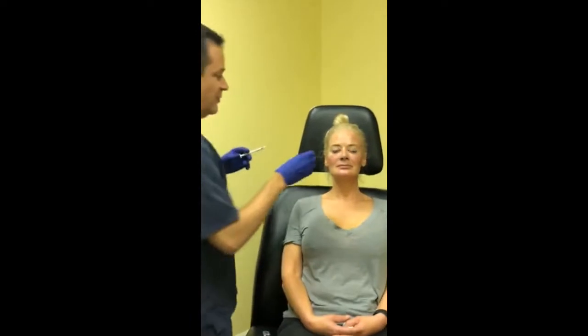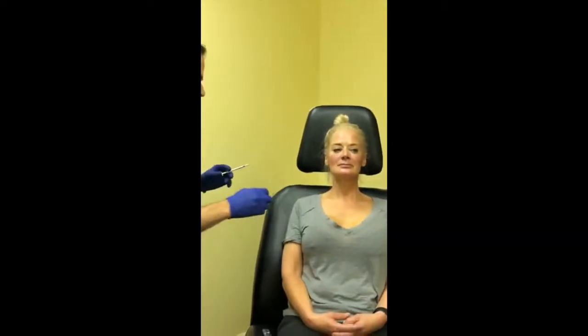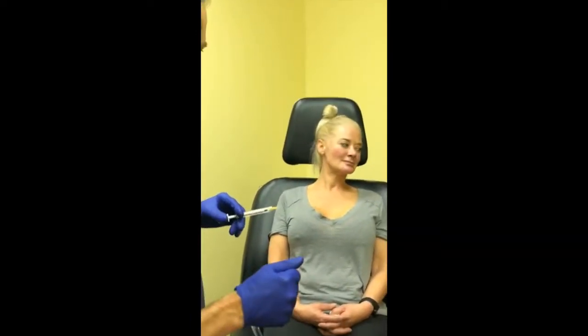Still on the first syringe. Look at her — just the temples alone. I would have never even thought to do that. It looks like it took 10 years off.